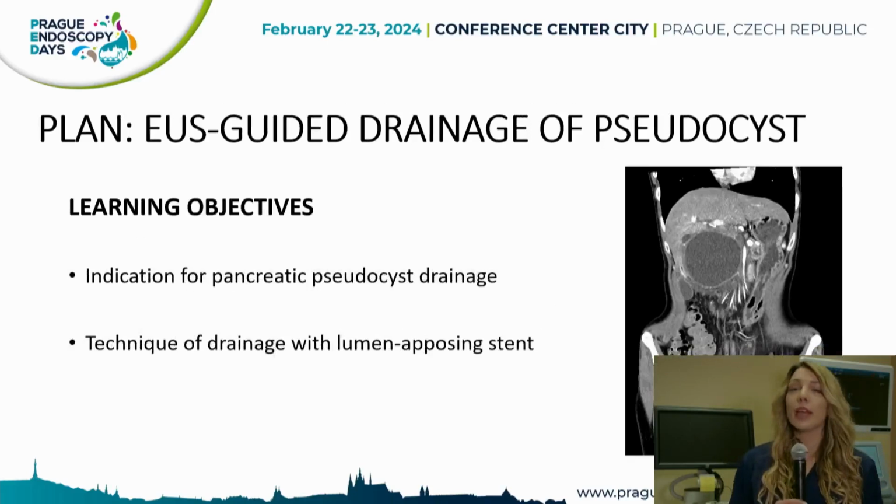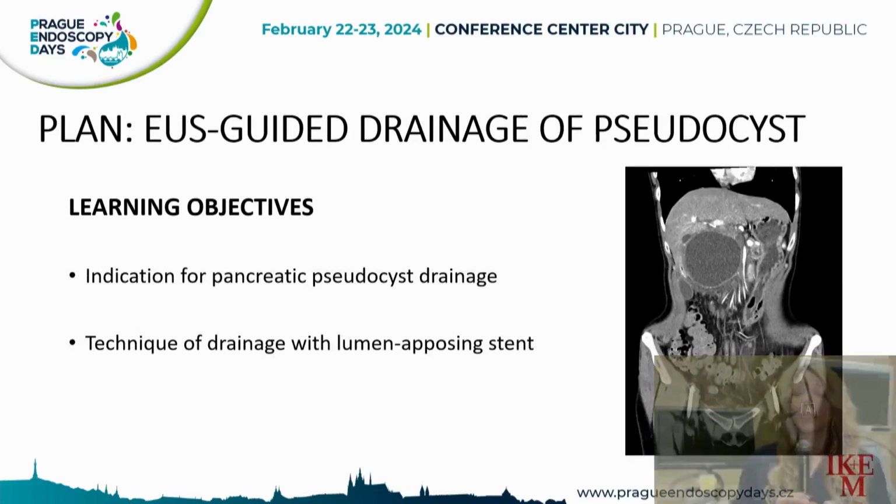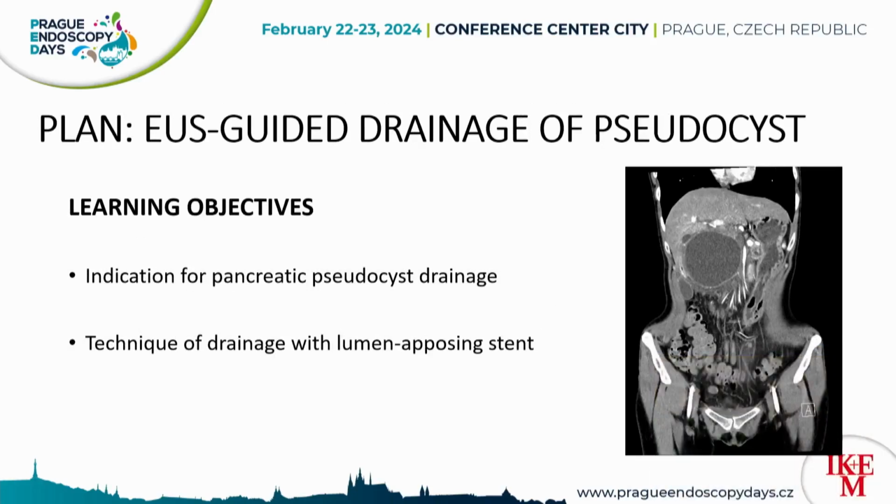And now we will show endosonographically guided drainage of this pseudocyst. It will be performed by Professor Binmoeller with the assistance of Professor Reichert. We will talk about the indications for pancreatic pseudocyst drainage and the technique of drainage using a lumen-apposing stent. Now to the endoscopy room.